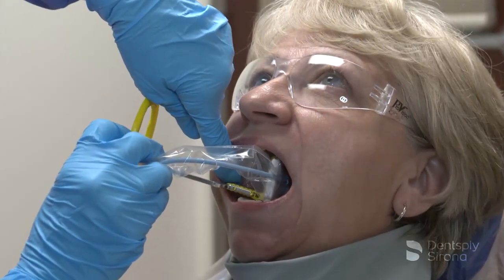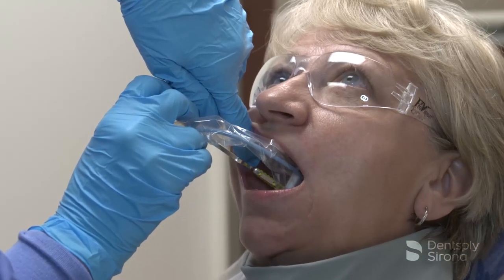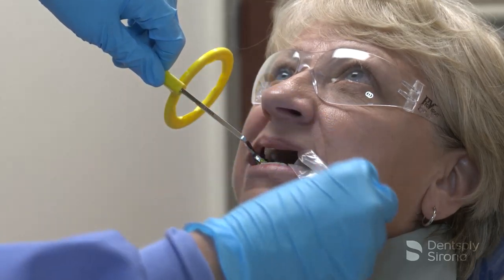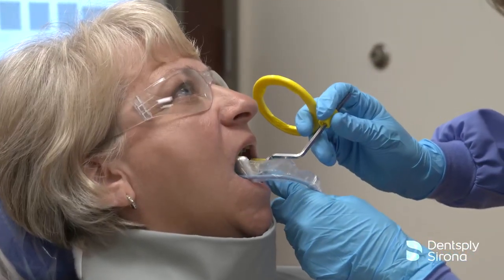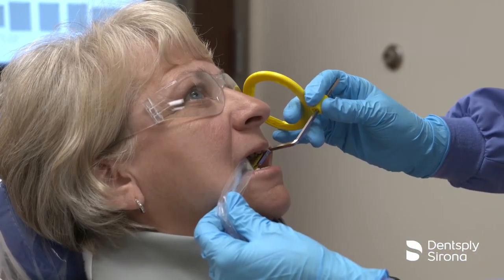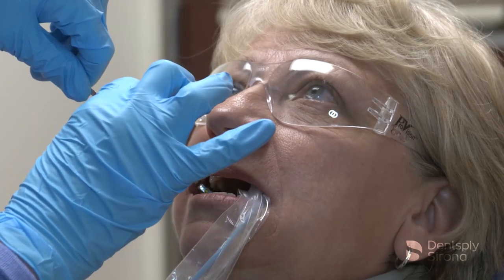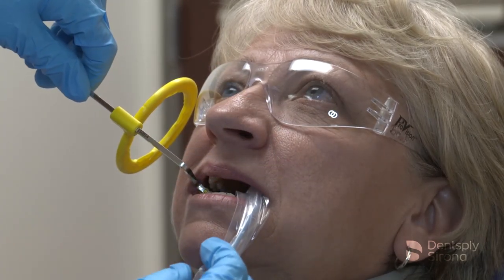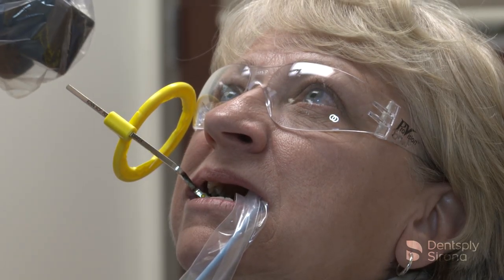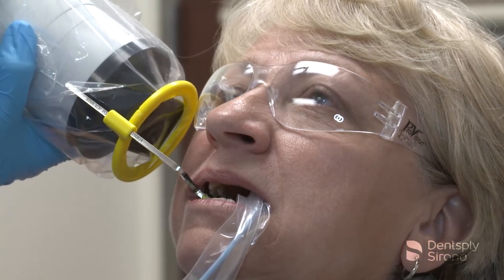To capture images of the maxillary molars, position the image receptor in the patient's mouth in the mid-palate region, allowing the sensor to find its way comfortably by resting the bite block on the second molar's occlusal surface. Ensure that the mesial edge of the bite block is between the first and second molar contact point. Once the bite block is in place, slide the aiming ring down the arm close to the patient's face, align the tube head, and the X-ray image is ready to be captured.